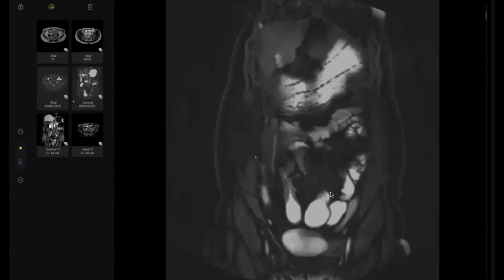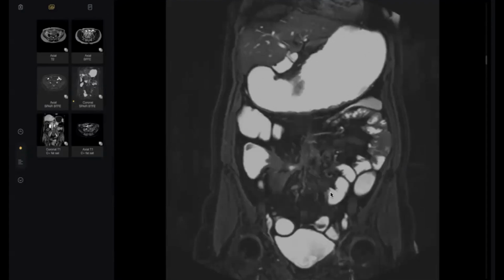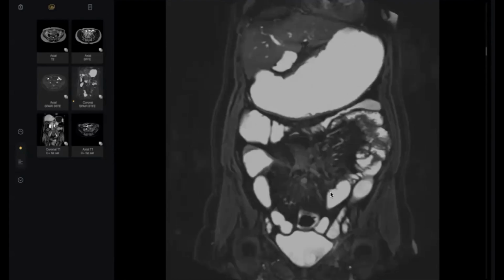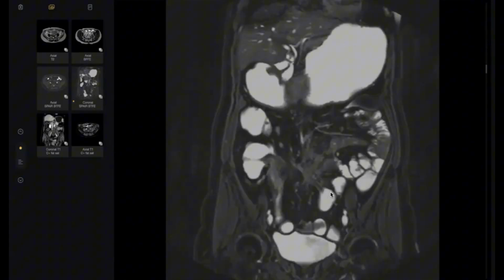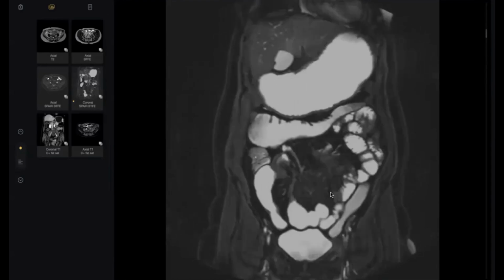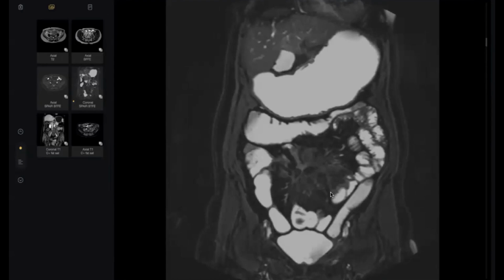I will think in line of possibility of ileal thickening, tuberculosis or Crohn's disease. No tuberculosis at all. Discontinuous, non-continuous inflammatory process of the ileum. What does it mean for you?